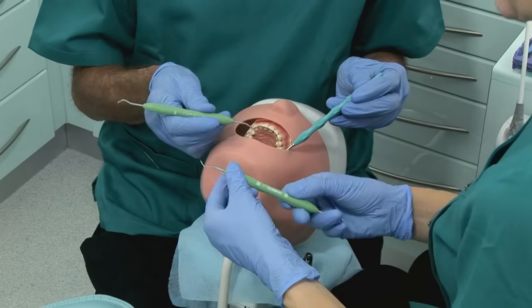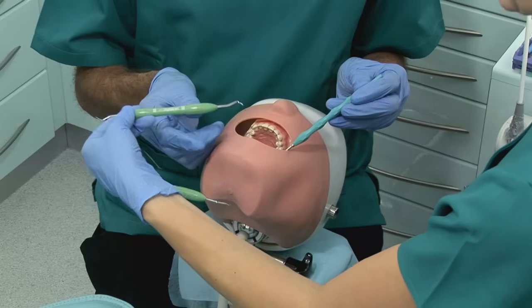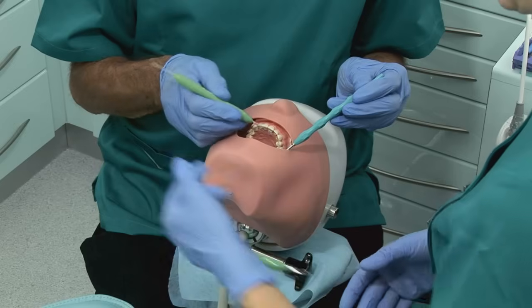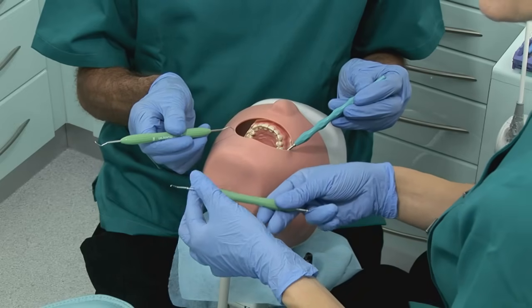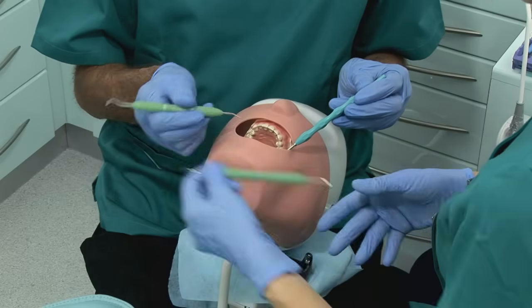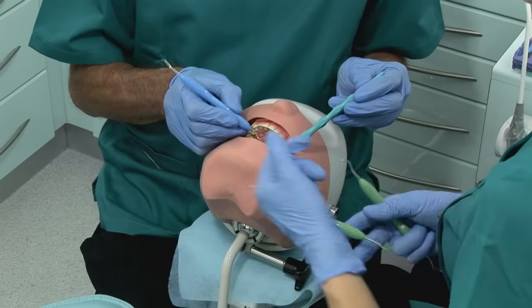When we're exchanging instruments, I'm doing exactly the same again, but I'm taking the bottom instrument, and we've got a parallel exchange going on, and then dropping the instrument down into his fingers. So just slowly doing that. I'm actually transferring the instrument back up because it's a slightly firmer way of passing than keeping it in your little finger. So I'm changing and placing. And if we need to move on to the next instrument, I'm able to just reach it, pass it across, and the same technique applies.